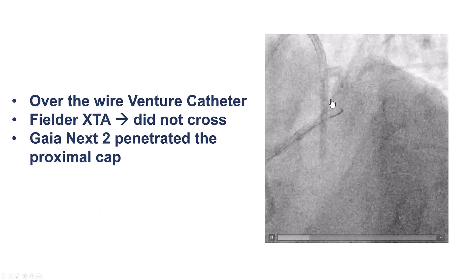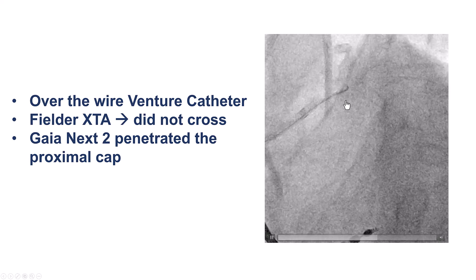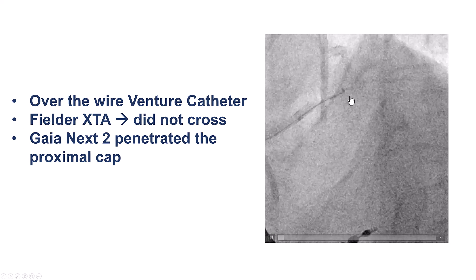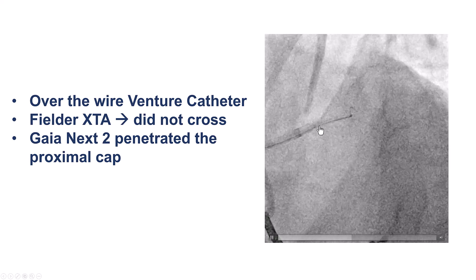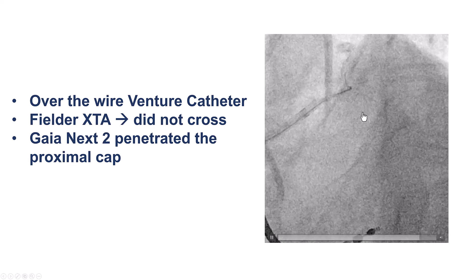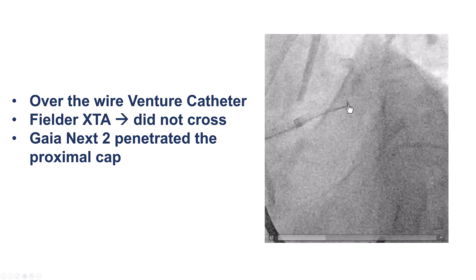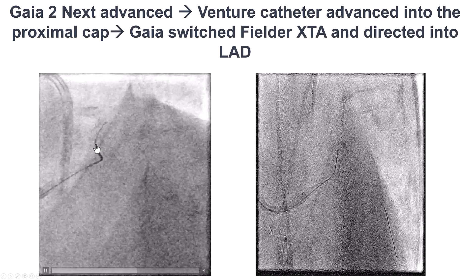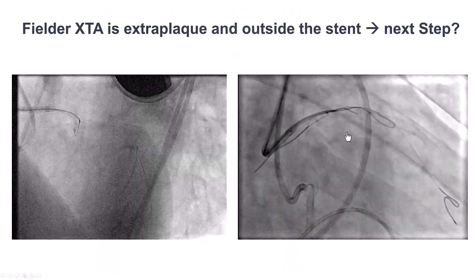We were not able to advance any wires because of the significant bend, about 90 degrees. For lesions like this, either in the circumflex or the LAD, the Venture catheter can be very useful. The Venture provides strong support. We can turn the knob on the proximal end and turn the distal tip up to 90 degrees. Fielder XTA did not work, but then trying a Gaia-NX2, we were able to advance inside the proximal cap. We were then able to advance the Gaia-NX2 further inside the lesion and then follow with the Venture microcatheter after straightening the tip.